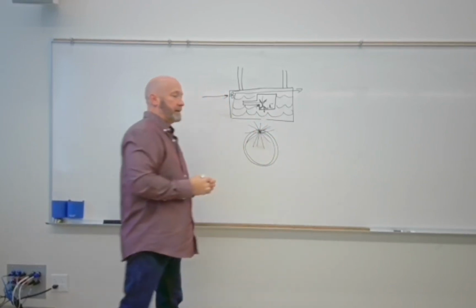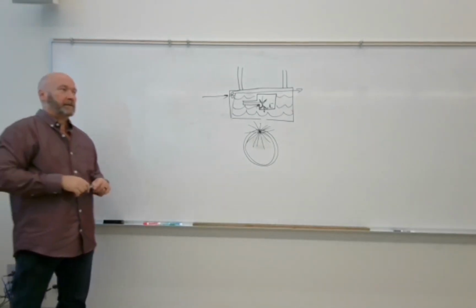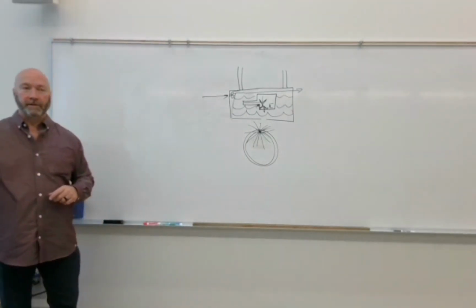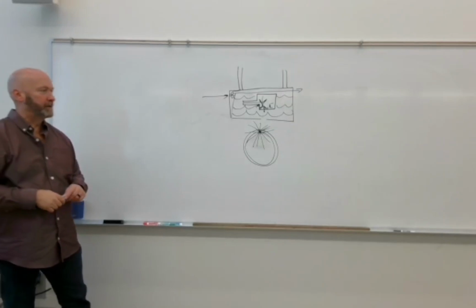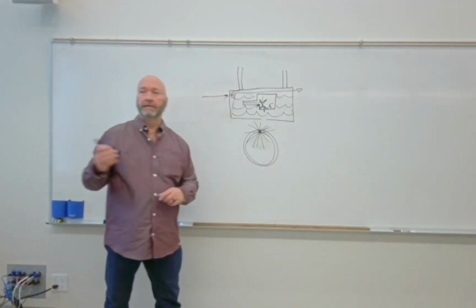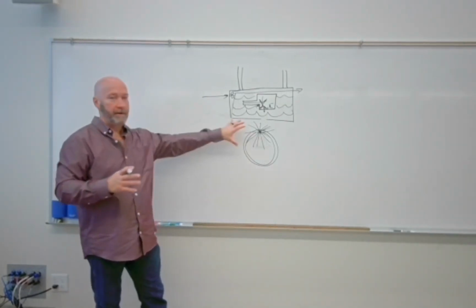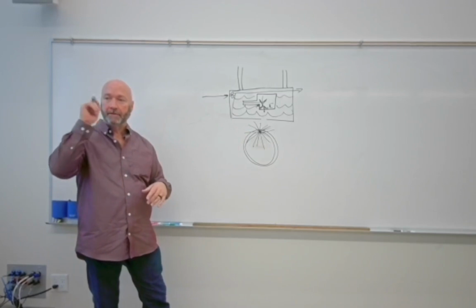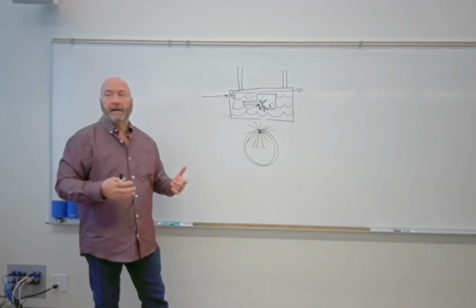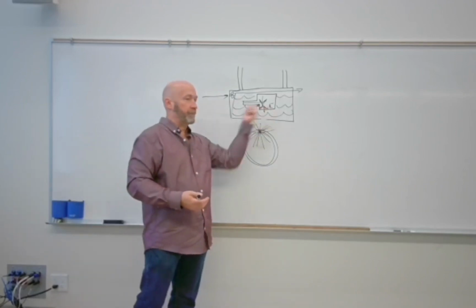So I've got a couple of videos on YouTube. Biomed guy used to work at ETMC, passed away, kind of young. He passed away a few years ago. He sent me some images or some videos where he took the collimator housing off so that you could see up into the X-ray tube, and you could actually see the electrons jump up from cathode to anode.